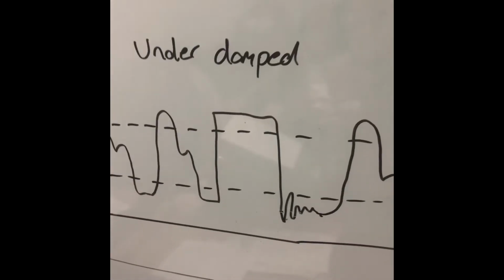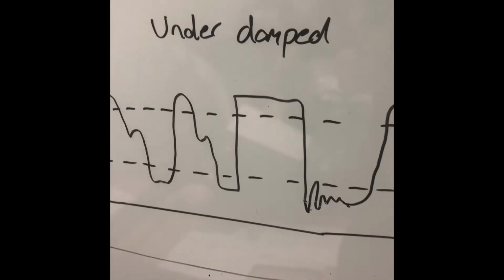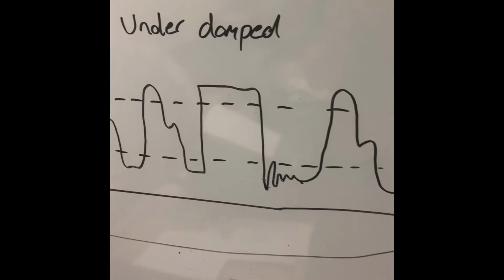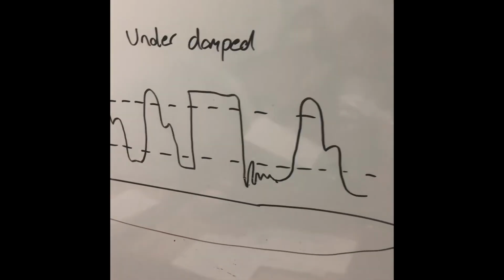Some common causes for an under-damped line is not enough pressure in the pressure bag, or there's no fluid at all, you haven't primed the line, excessive tube length, or there's a very high cardiac output. All right, now we'll go through some considerations. Now the considerations of transporting a patient with an arterial line is, if the pressure transducer is not leveled at the phlebostatic axis, there will be different pressures exerted on the diaphragm. For example, there'll be an increase in pressure when the transducer is below the phlebostatic axis, or there'll be a decrease when it is above, so this will not show accurate pressures.